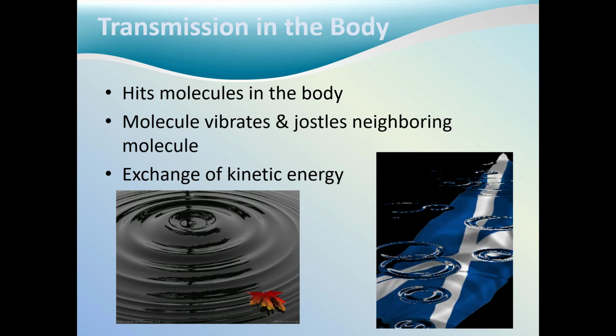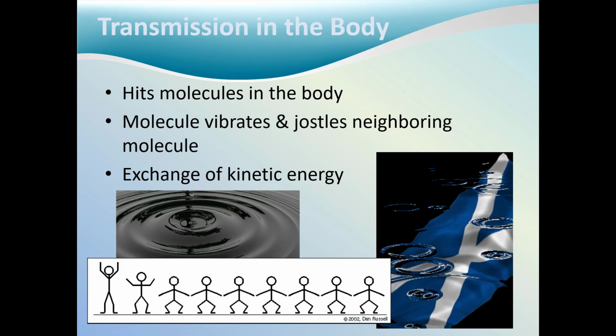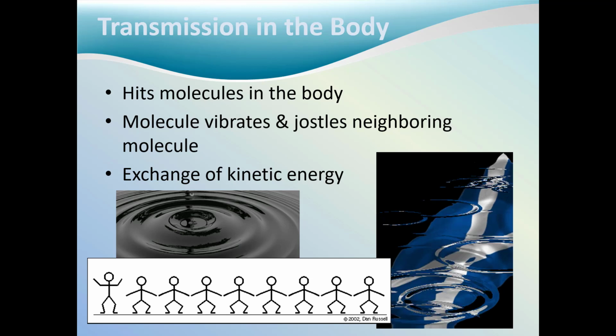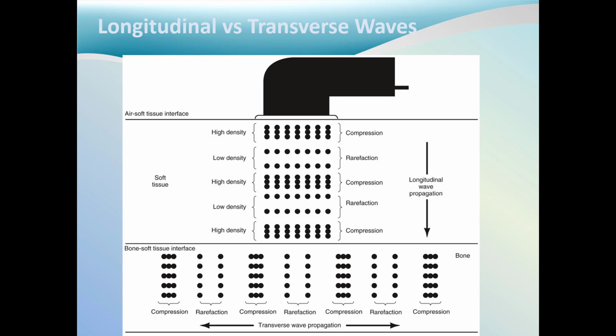We see a similar phenomenon occurring with ultrasound application to tissues. When ultrasound is applied, acoustical energy causes the molecules to vibrate and bounce into each other and affect the next molecule, and so on. The acoustical waves are transmitted to the tissue either as longitudinal or transverse waves, depending upon the tissue that the ultrasound is targeting. This will result in either longitudinal or transverse waves that occur in the body.